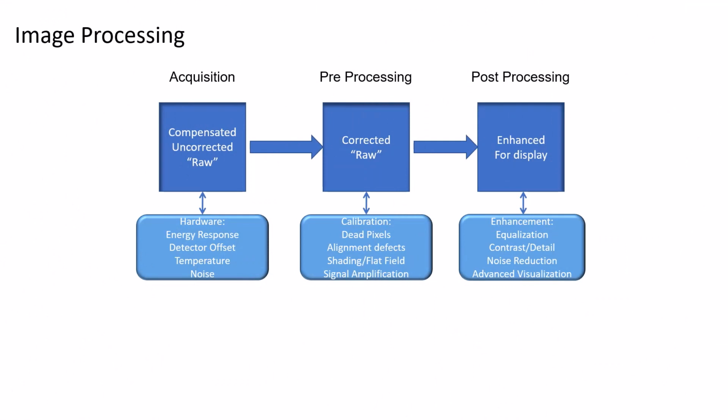So let's take a moment to look at image processing: acquisition, pre-processing, and post-processing.